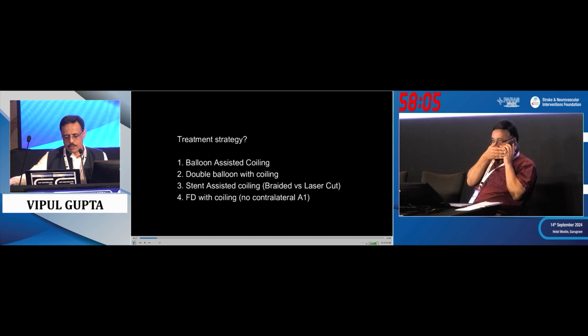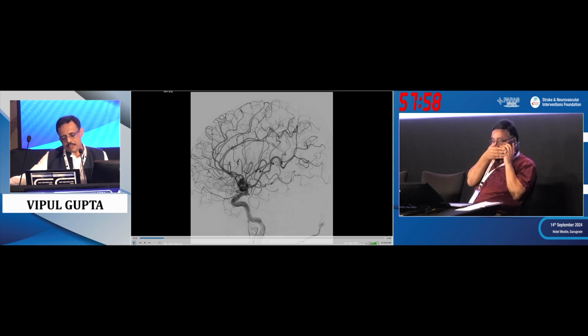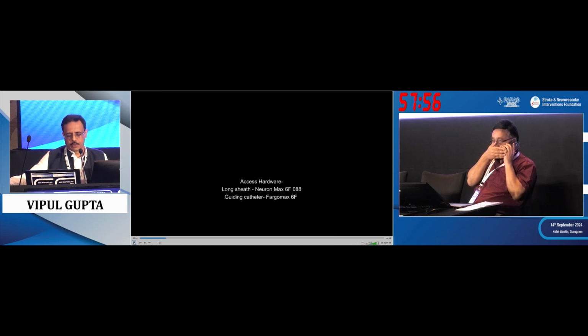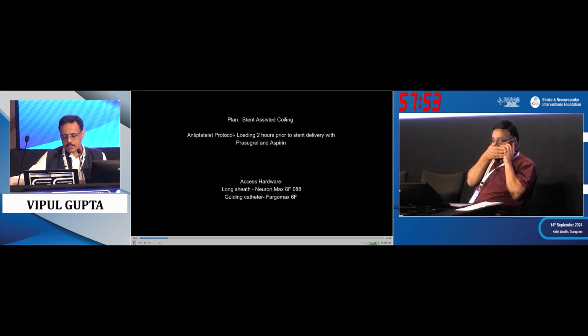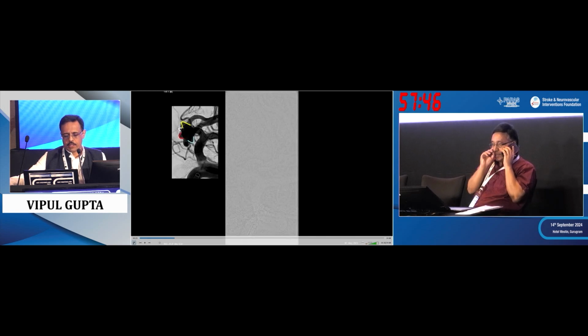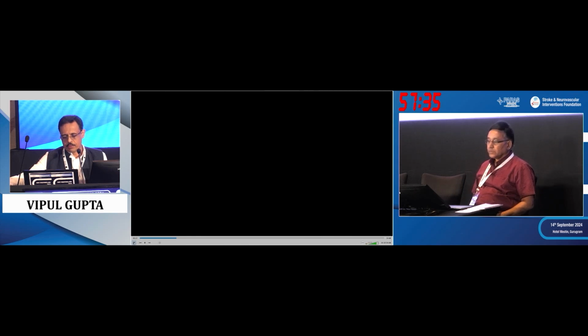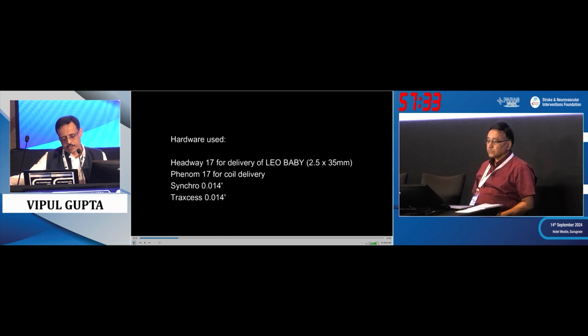And so we went ahead with stent-assisted coiling because we had to be sure we get all those irregular lobules. With balloon, if I stop and can't get the lobules, there's some filling, then we are really stuck with it, what to do. So again, we always take triaxial. This is one plane. Here you can see what we are trying to do, multiple irregular lobules. So I was worried that if some residual filling, stent should take care, and there was a near the neck lobule as well.